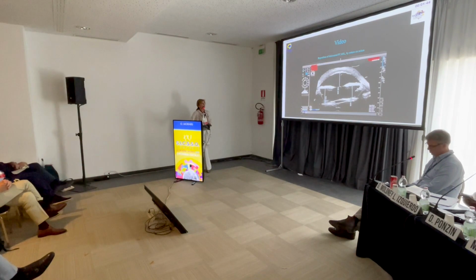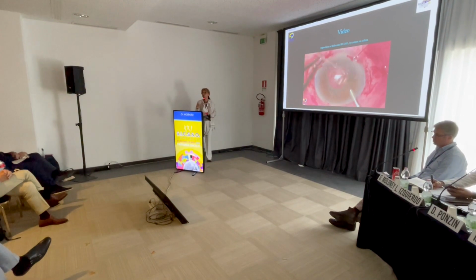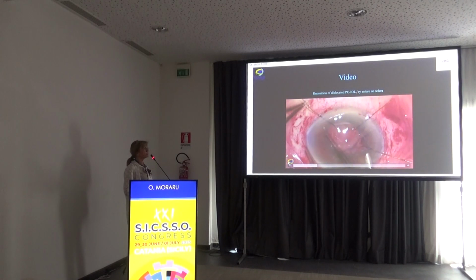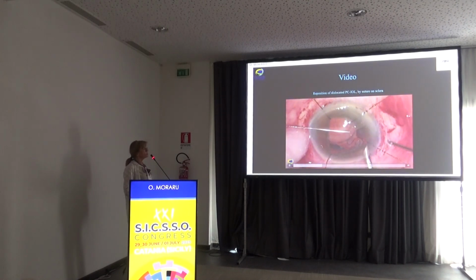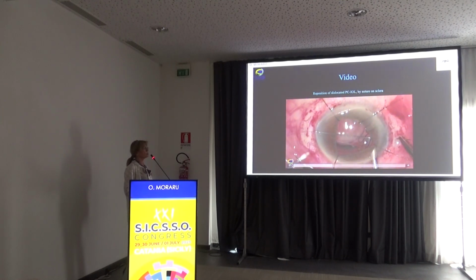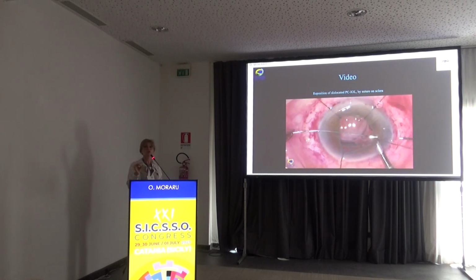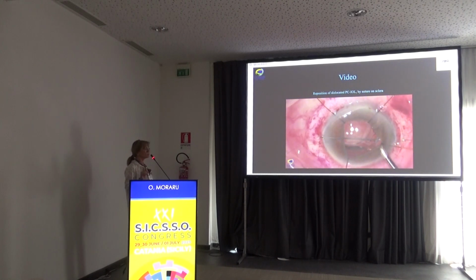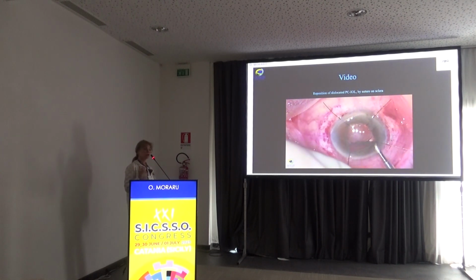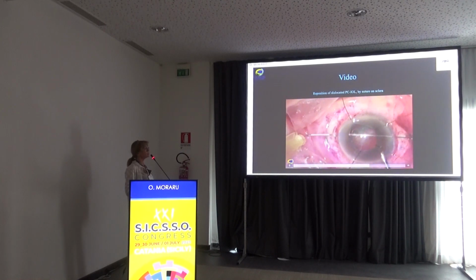And this is the third group of cases that I mentioned, all patients with pseudoexfoliative syndrome and posterior chamber IOL dislocated together with a bag. We used the anterior approach. We prepared scleral grooves because our intention is to keep this IOL, and we always keep the IOL when we have favorable IOLs, I mean IOLs which have holes on the haptics. It's a pity not to use them, and it's a less traumatic procedure instead of taking it out and exchanging with another IOL. We are using hooks to fixate the bag on the CCC.